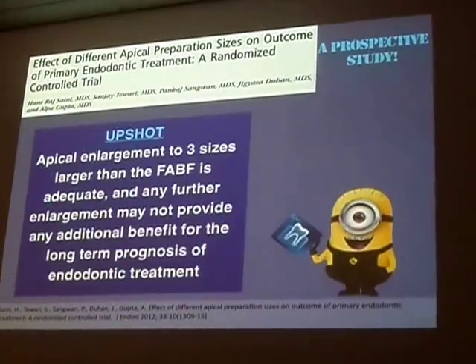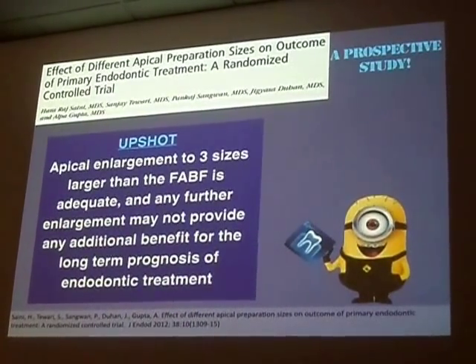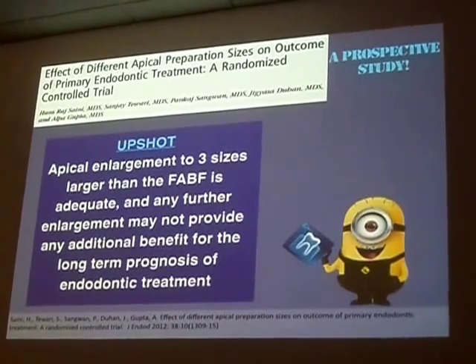And what he concludes is that perhaps instrumenting to 3 sizes larger than the first apical binding file is an adequate method for instrumentation.